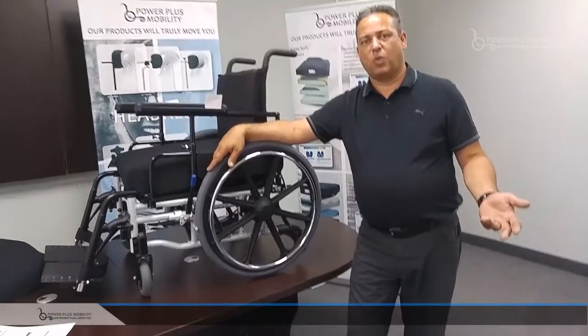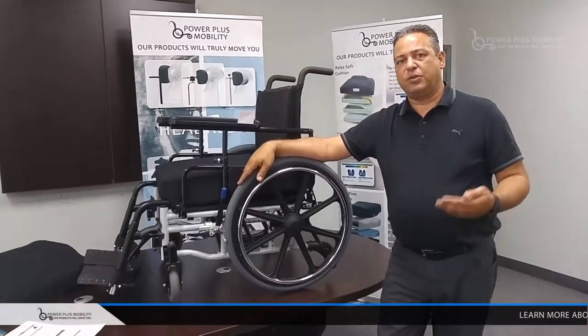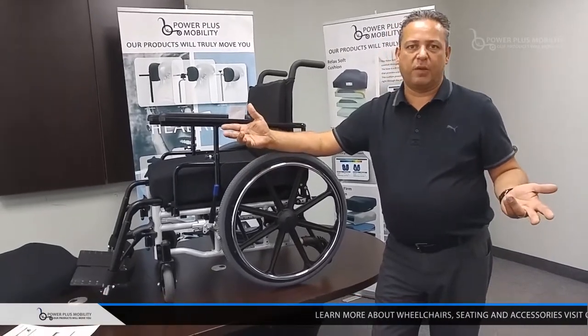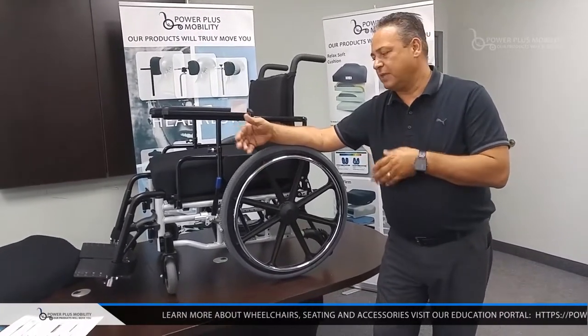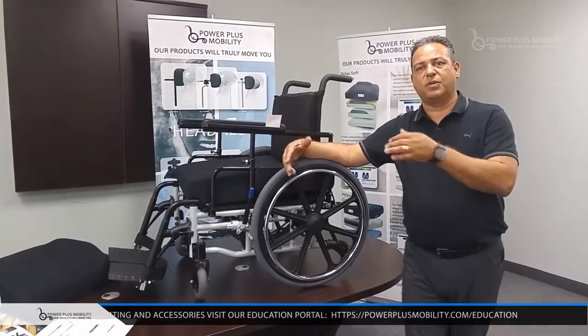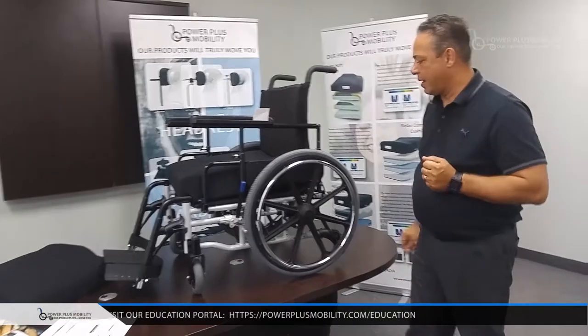We will go up to 30 inches wide on this chair and up to 24 inches deep. We do quite a bit of customization. Most commonly, because of its steel structure and durability, we tend to do 22s, 24s and onward for greater weight capacities.